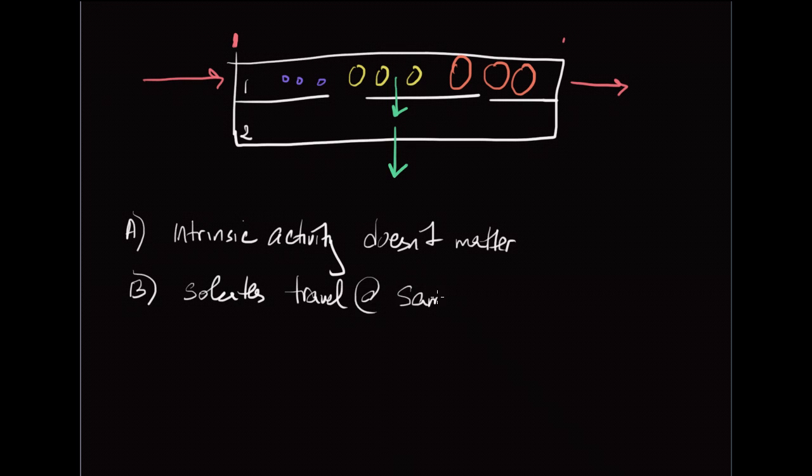Now, that doesn't mean to say that you're going to have the same concentration of large solutes in your blood as you do small solutes in your blood, because you're not starting out with the same amount of small solutes and large solutes, but your clearance, which is the rate at which you eliminate these solutes, will be the same when you use convection. So when is convection useful? It's useful when you have larger solutes, solutes that would not diffuse easily because their intrinsic activity is too large. Certain cytokines, in cases when you have sepsis, those cytokines may be removed a lot better with convection.